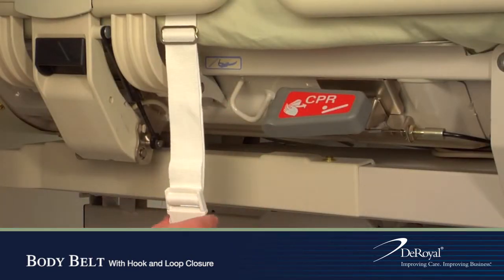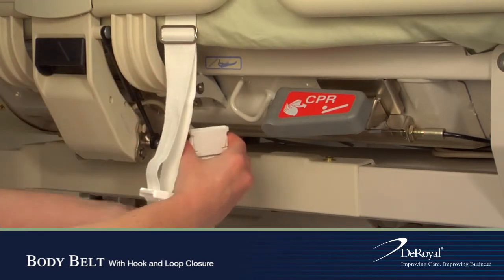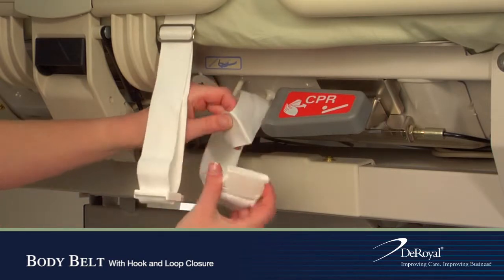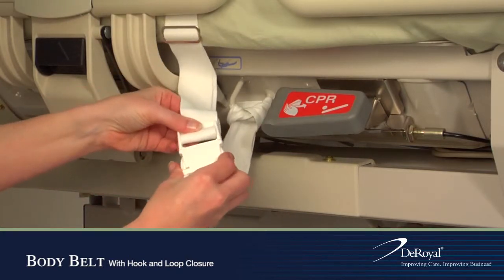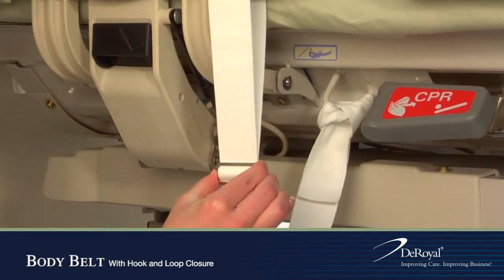Release the female end of the buckle and wrap its strap around the bed frame. Pull the female portion through the loop and connect the male and female ends of the buckle. Adjust the slide buckle on the strap to tighten.